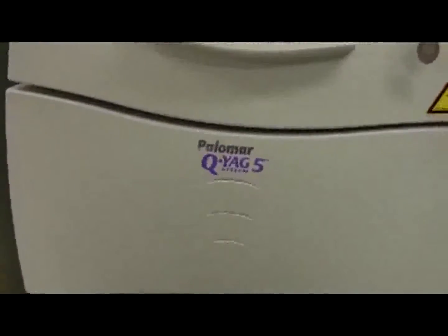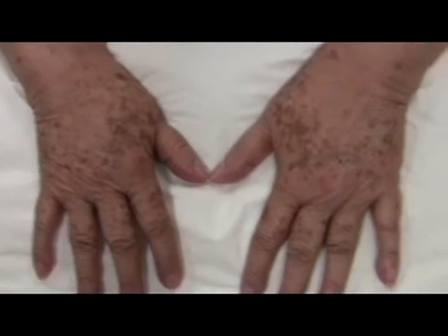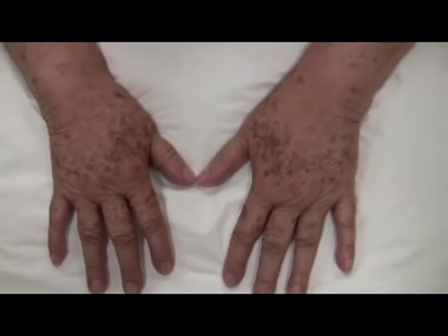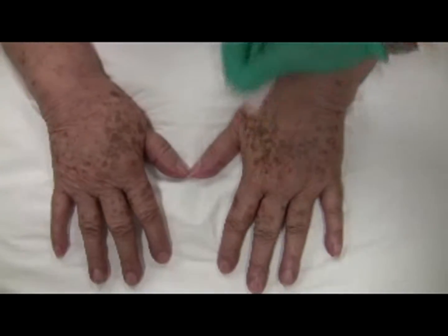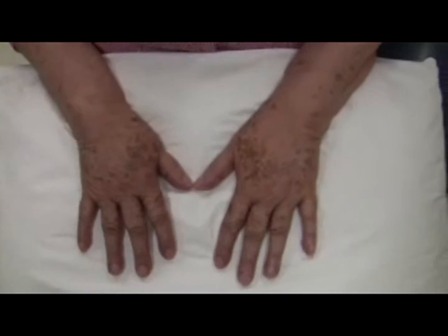Today we're going to learn how to work the Q-switch ND YAG laser in the context of treating solar lentigines. The first step is to clean the patient's hands because often they have cover-up — we did that before and you can see there's no makeup on the alcohol swab. The next step is to make sure that everyone's eyes are protected in the room.